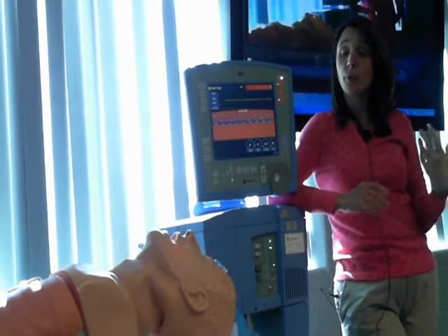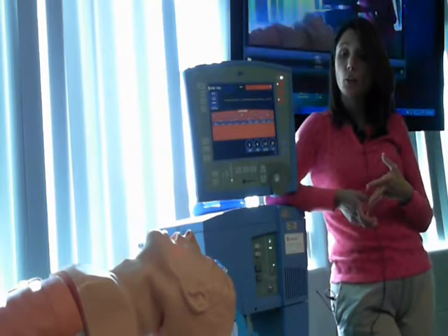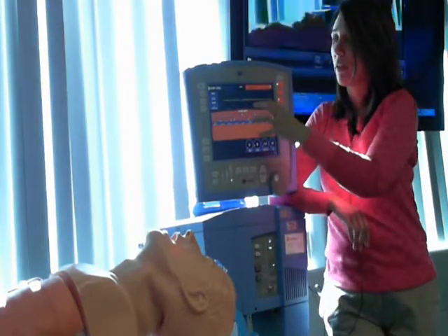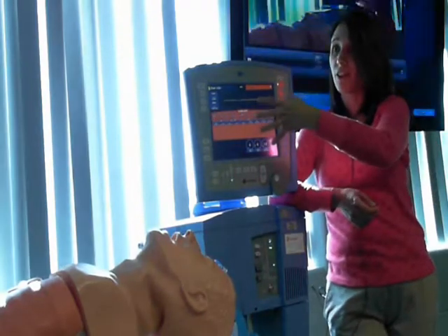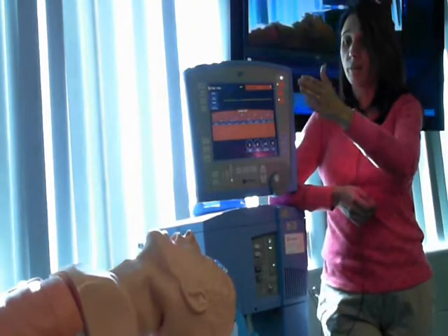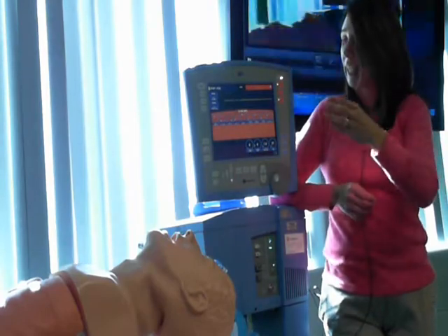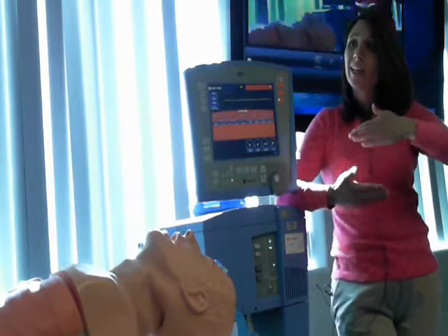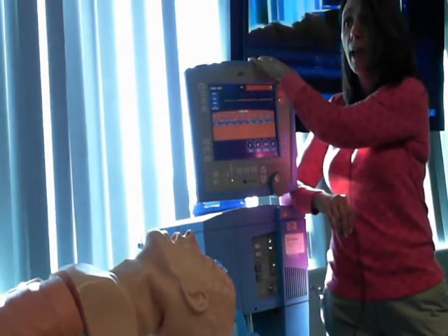Now, if you have hope of the spinal column healing, then you can actually trach them, and they can be on a lesser level of ventilatory support that will help retrain their muscles. So we start them out on full ventilatory support until we get them stable, and then as the patient becomes more stable and they need to progress to the rehab portion of their care, then we can change the ventilator setting to focus more on, are we going to get any muscle strength back? Particularly with the injuries you were talking about.